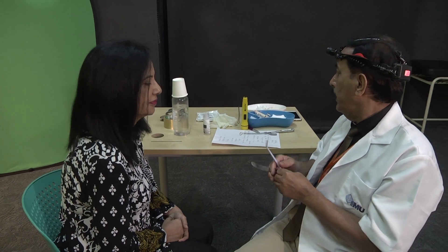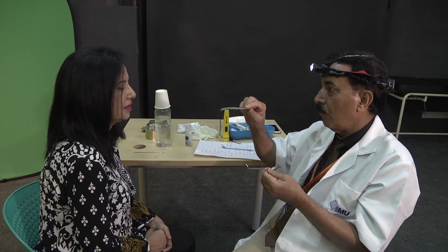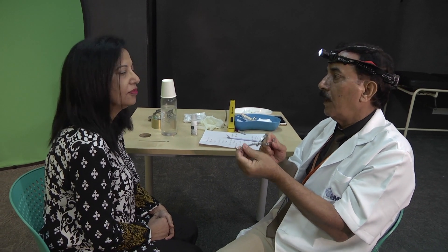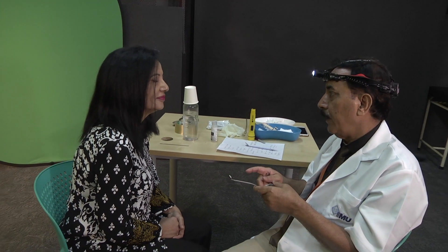Okay, so this examination will use a mirror and a tongue depressor. I'll introduce this tongue depressor to hold your tongue, and then I will be using this mirror. It won't hurt you, but in case you feel pain, let me know.